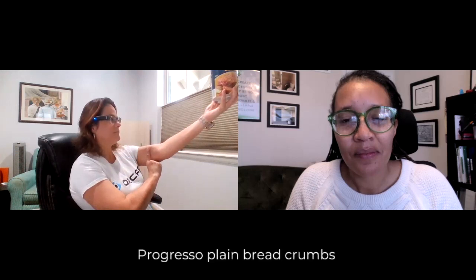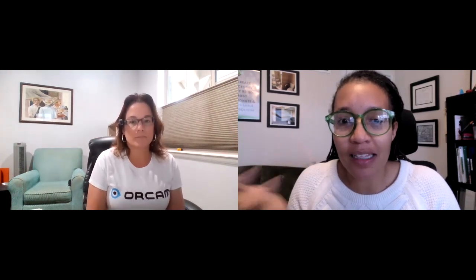Don't have the canned soup, but I have this breadcrumbs. And I'm just going to show you, I'm going to put the device on my glasses with the magnets. Oh, so it just said breadcrumbs. It took a picture. Is that what it's doing? Taking a picture of the barcode, understanding it, and then telling you back verbally what that barcode is. Exactly. That's what it does.